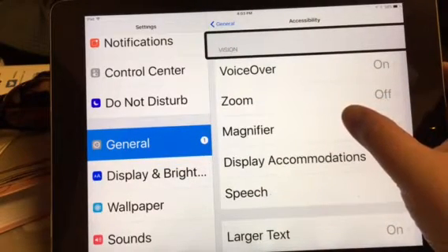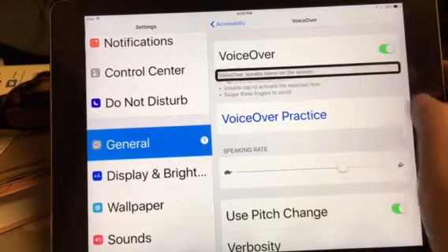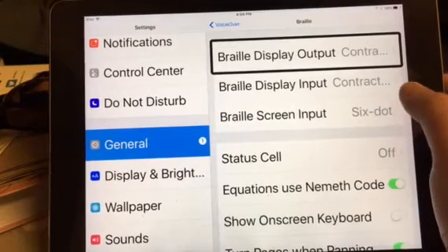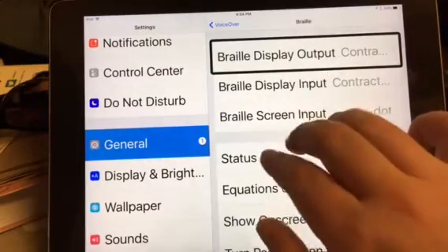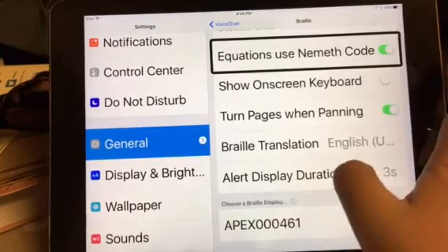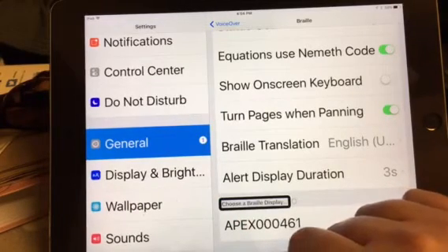You're going to go down to VoiceOver. Double tap. Now you're going to want to go down to Braille. Double tap on Braille. You're going to use three fingers to swipe upwards on the screen to get down to the very bottom of the screen. At the bottom of the screen, it'll have a category that says 'Choose Braille Display.'